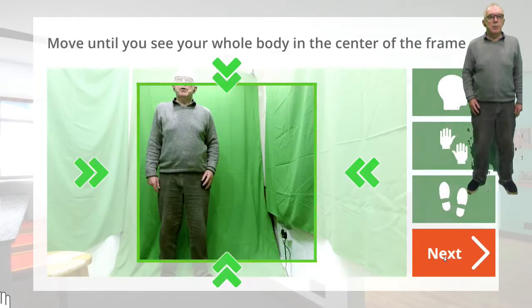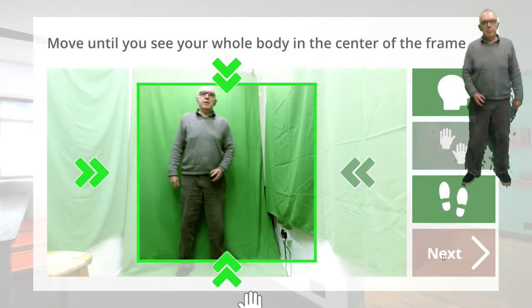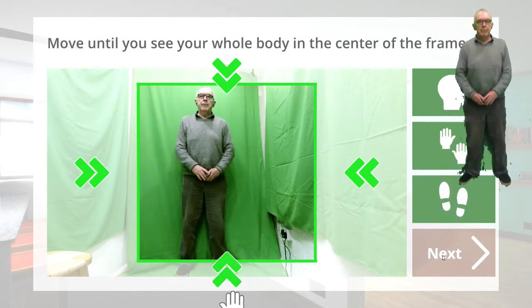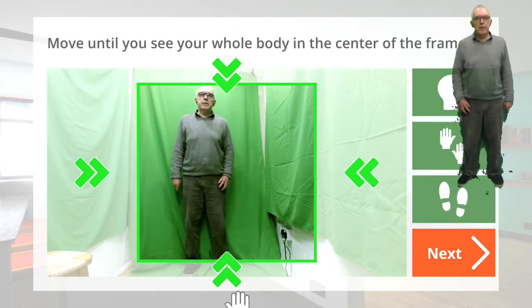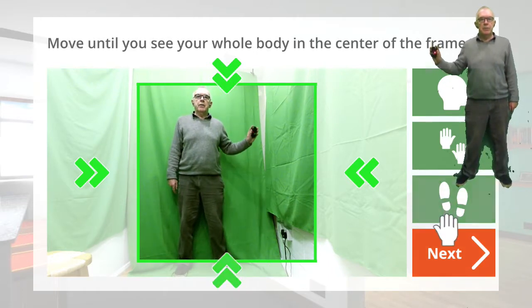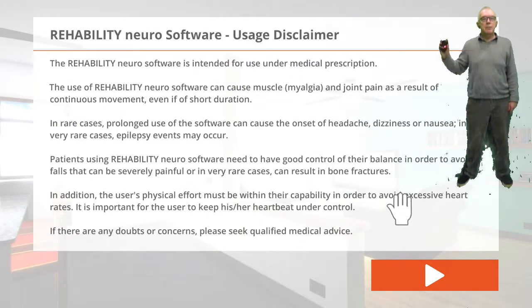Now, from this point onwards, I have to set myself up so that the Kinect can recognize where I am, and it can recognize my movement. So I move my body into the center of the frame, and I'm now going to move my hand, and you can see from this point onwards I'm using my hand to control the Neuro software.